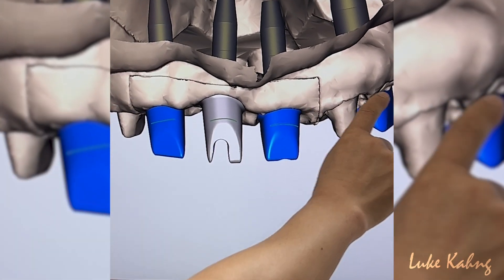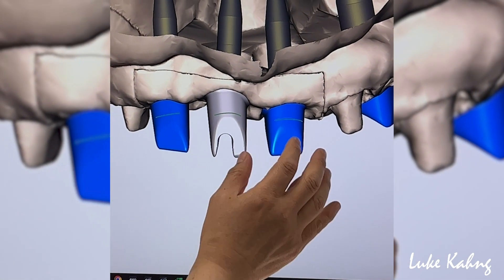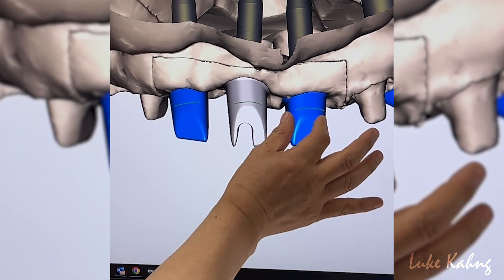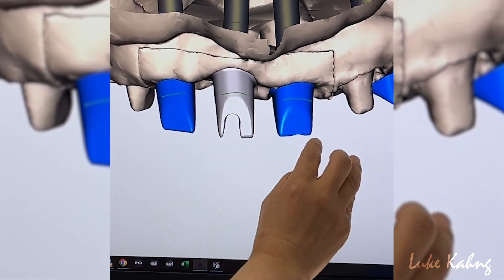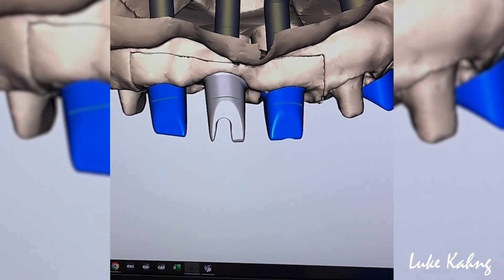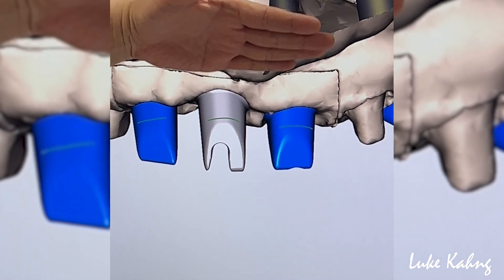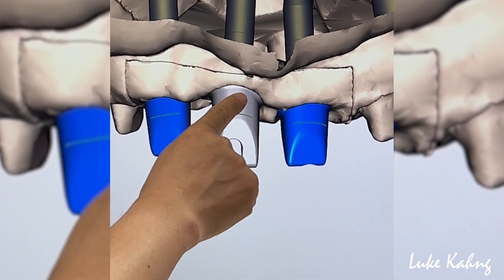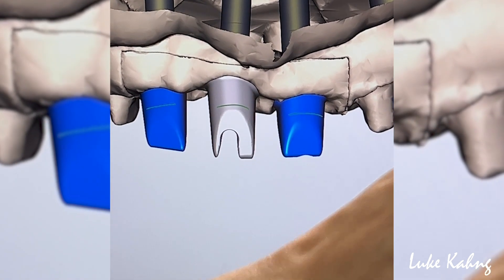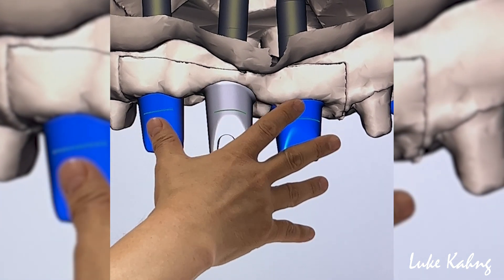I'm going to make the same level. That's my issue with what I had here. So first, you can go down a little bit more, bring it in, make smaller, cut as much as possible, and move it more facially. My problem is the big case — the aesthetic line will not be pleasing compared to here. So whenever the patient smiles, they immediately notice — it's pink, and then there's an up-and-down cosmetic problem.